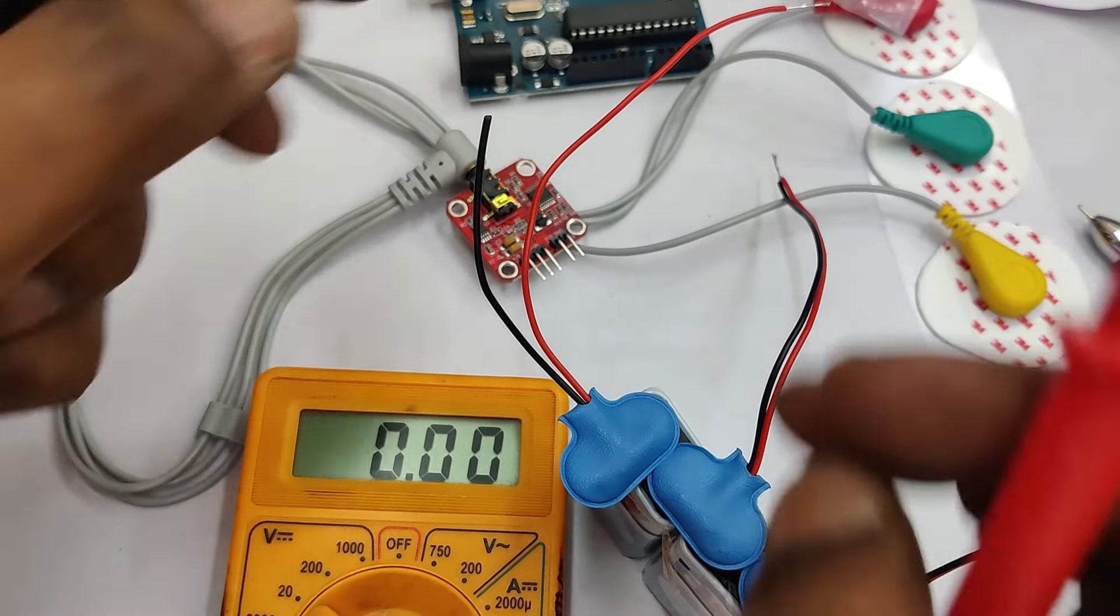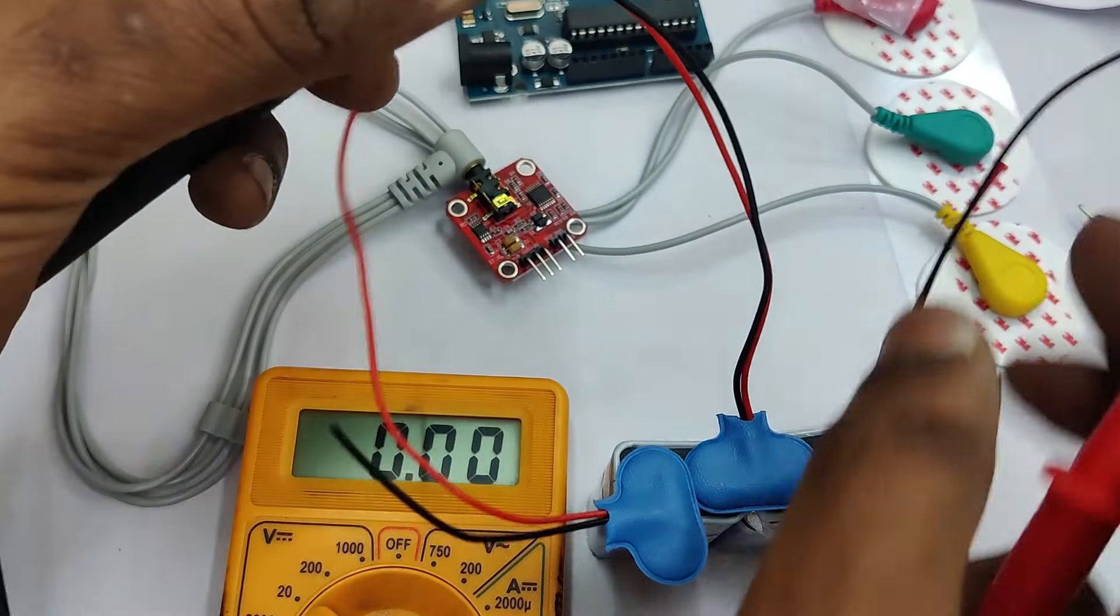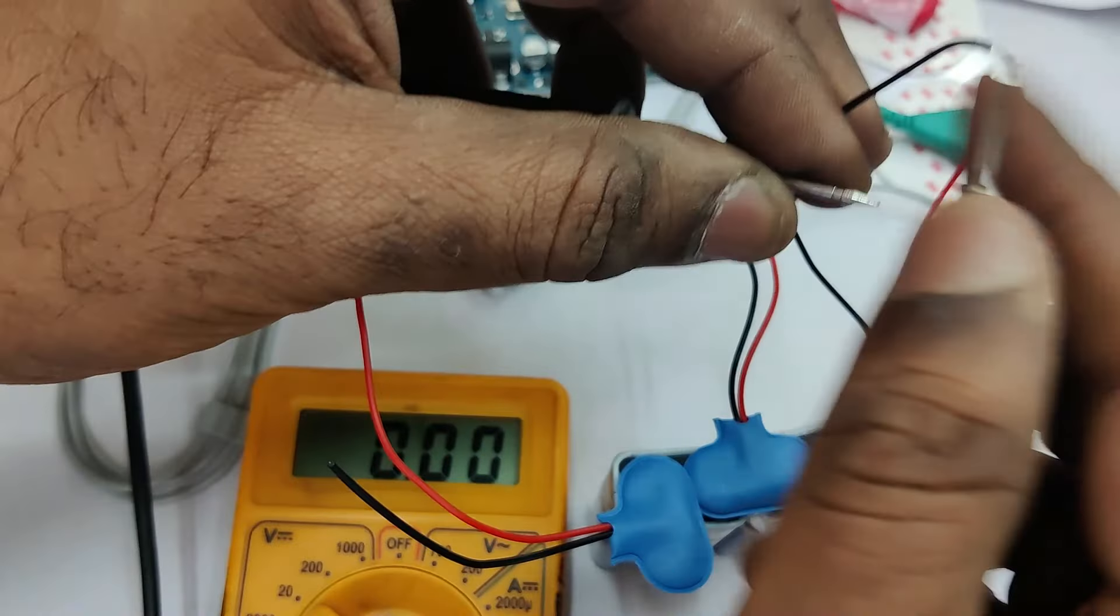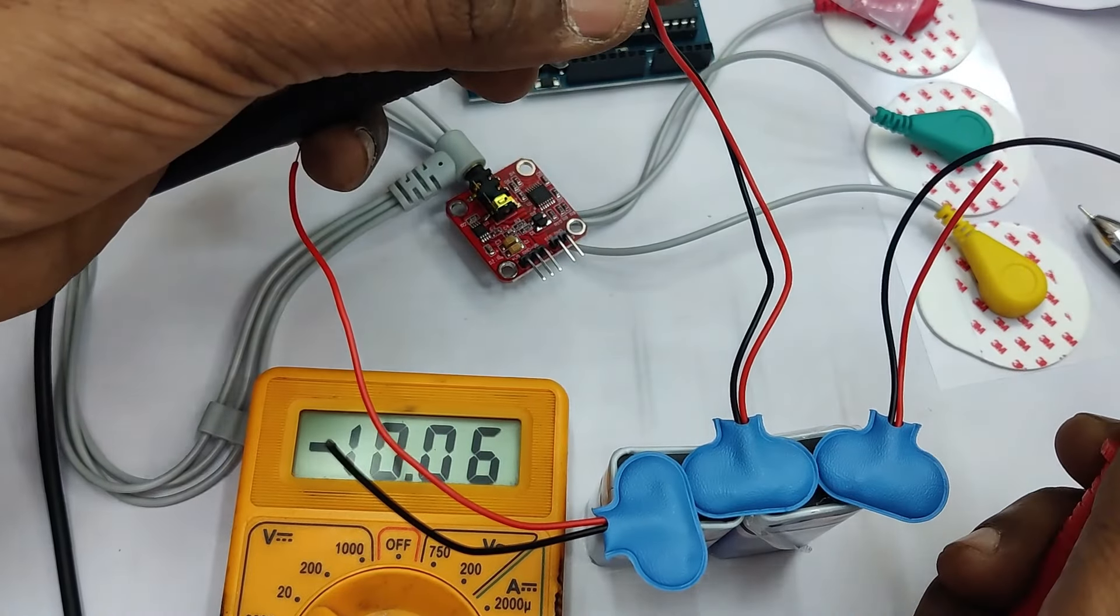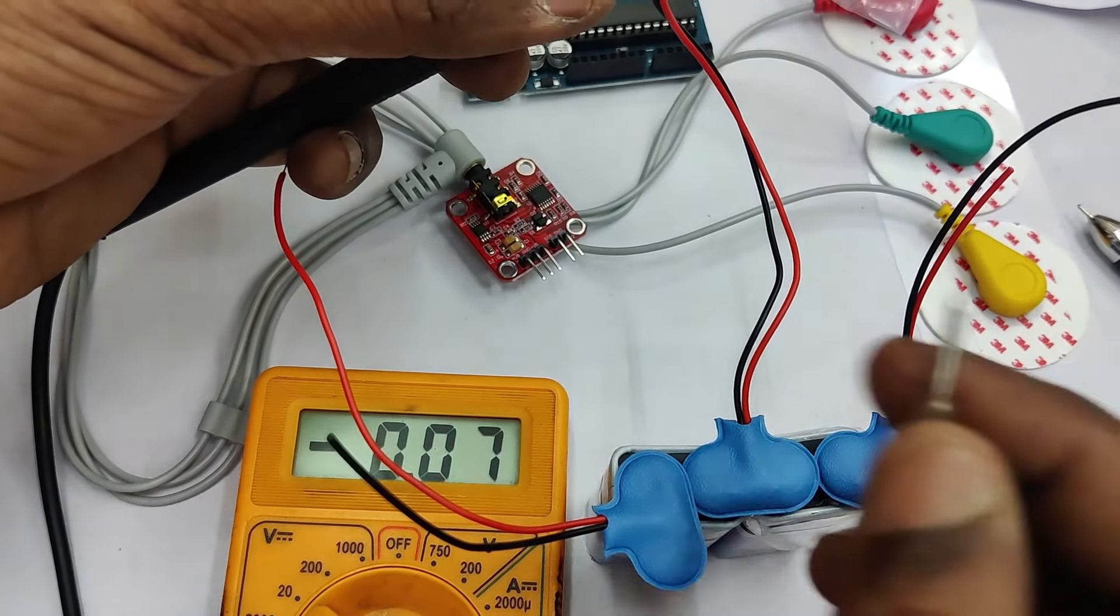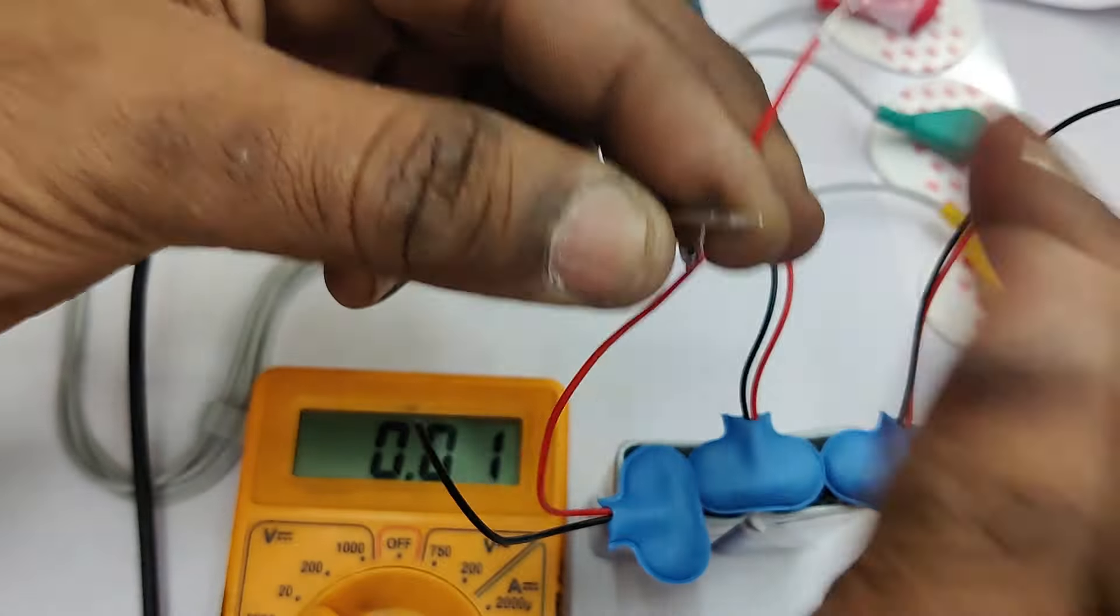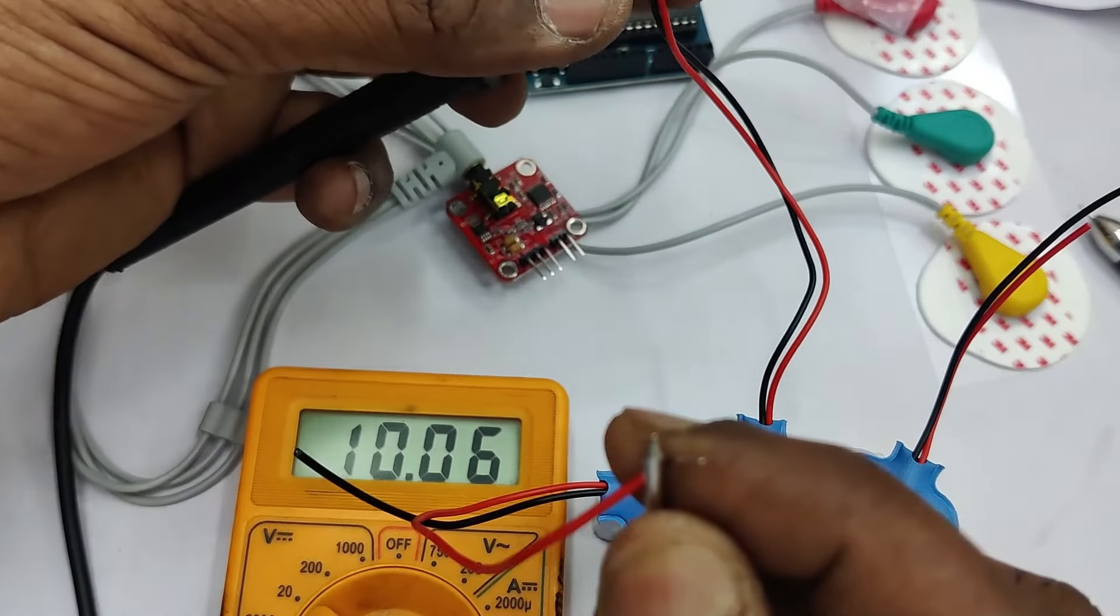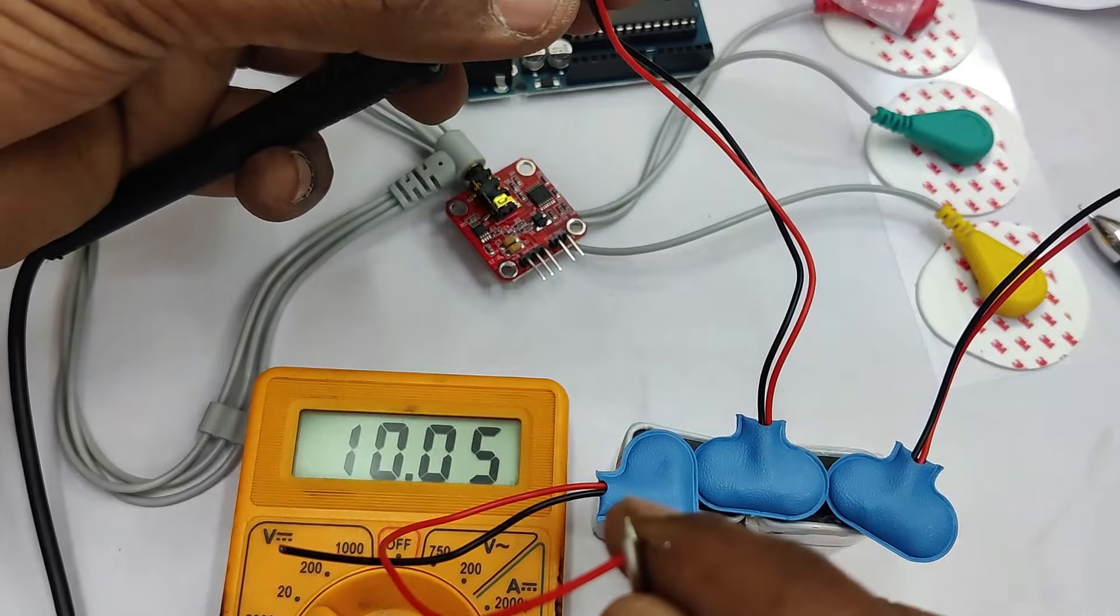Now let us check with the multimeter. Center pin, let us keep the black probe and the black wire with black wire. It shows minus 10 volt. The red wire it shows plus 10 volt as it is fresh battery.